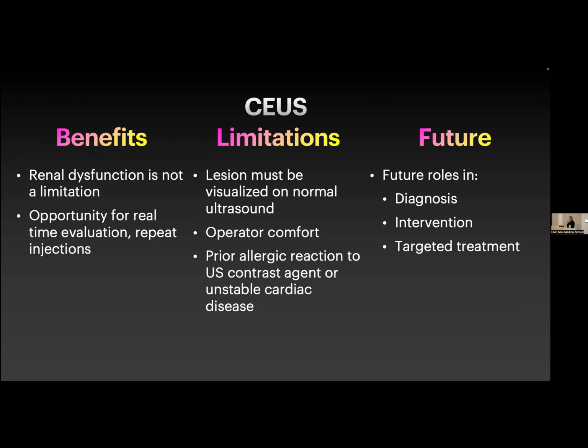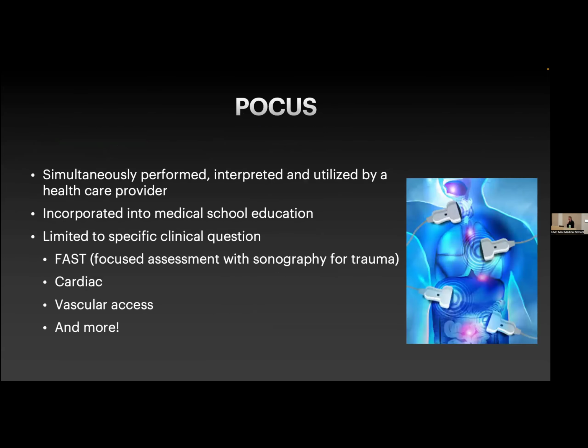So really great opportunities, and I really am excited to see where contrast enhanced ultrasound goes in the future. And last but not least, point of care ultrasound. I mentioned this a little bit before, but this is just simultaneously performed, interpreted ultrasound that is then utilized by that single individual healthcare provider.